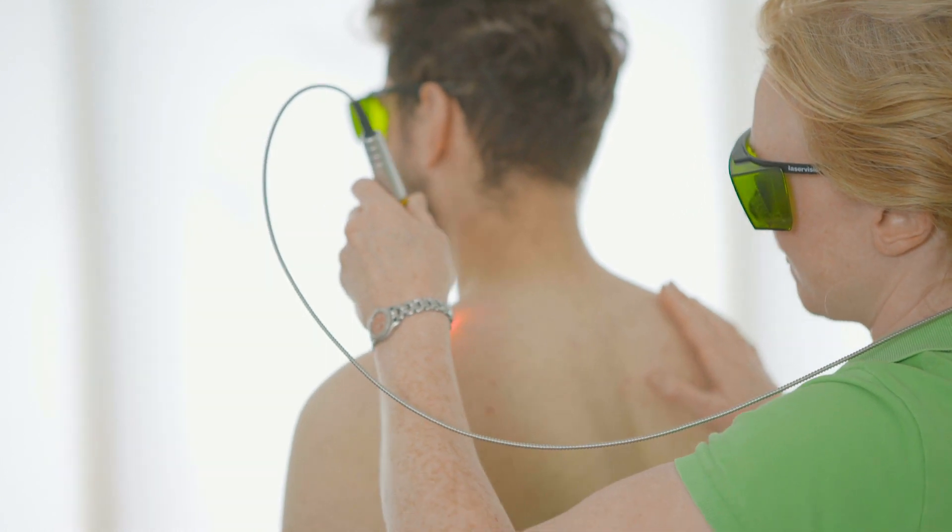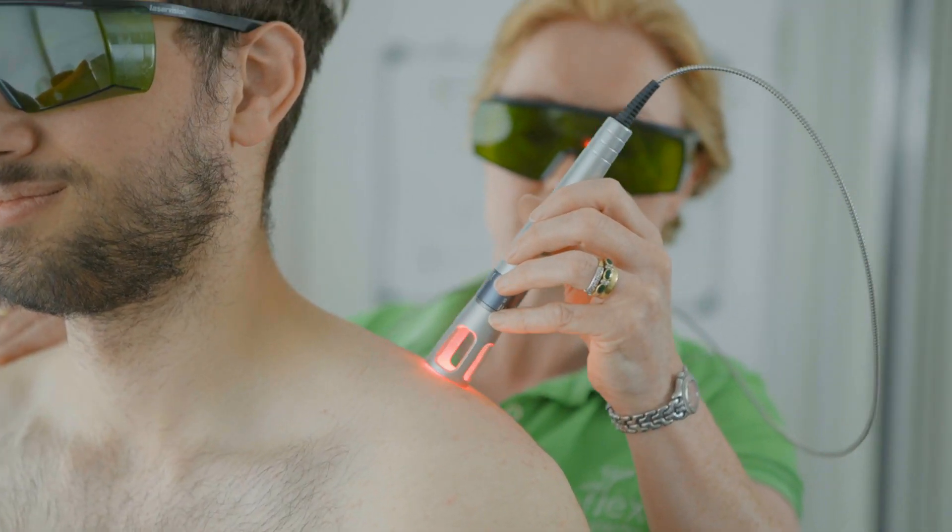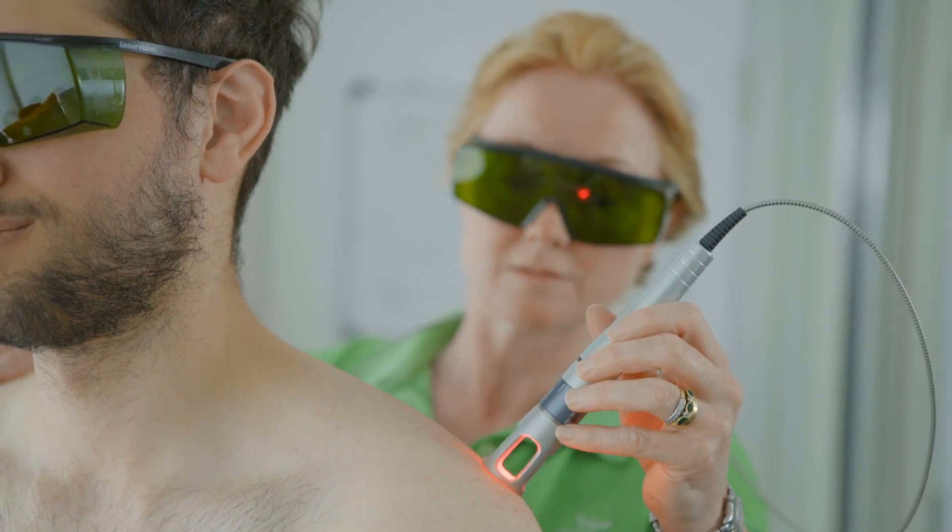That stimulation brings in more blood, therefore more oxygen, and allows the body's natural healing process to occur. We keep moving the laser over the area that we're treating throughout the session.